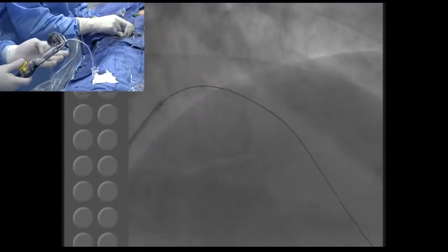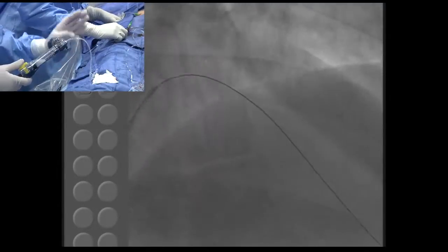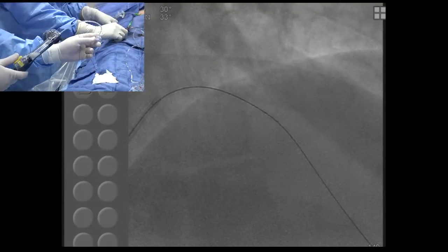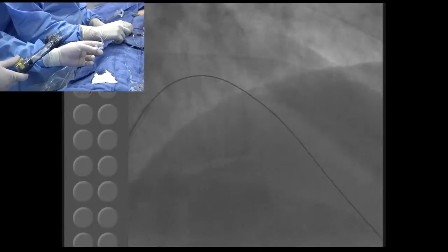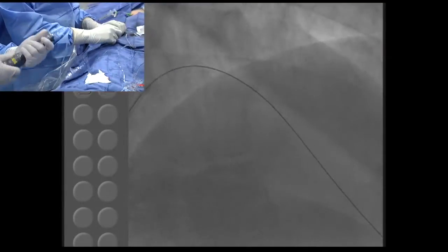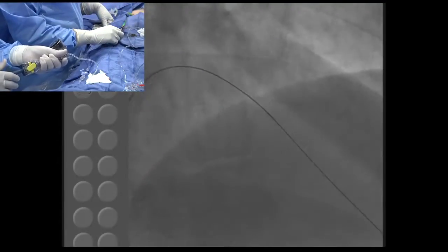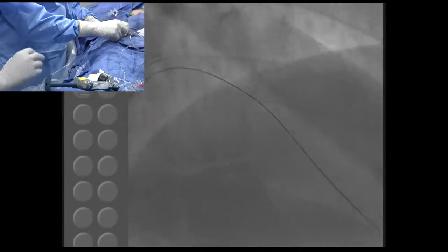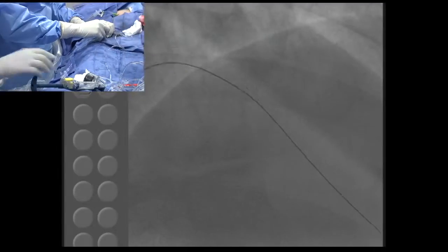Now, since the purpose has been served, you bring back the GuideLiner, because the GuideLiner will cause some ischemia and ventricularization of the tracing. Go a little further. Yeah, done. Good. I would still say that you probably need a long balloon, 2.0 by 30. We have the 2.5 with the high pressure? Yeah. Okay. Go here.